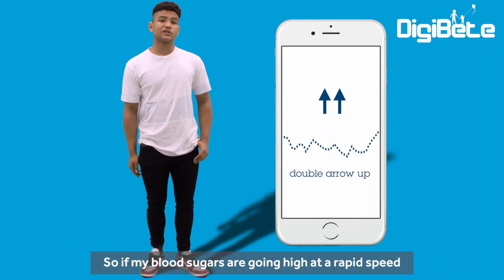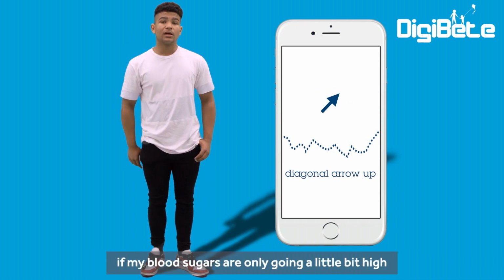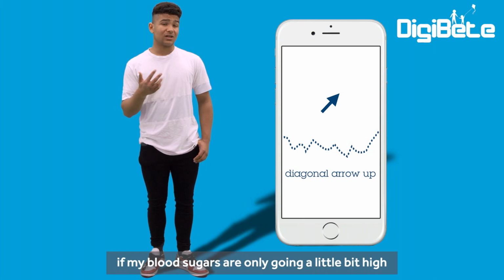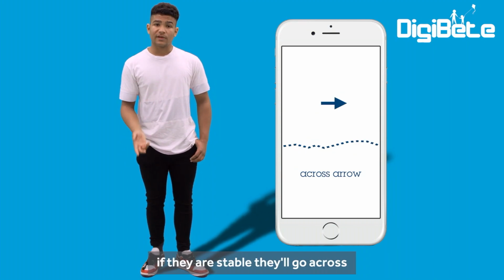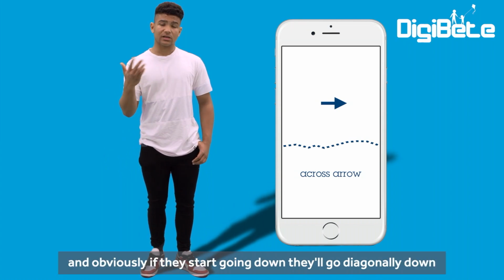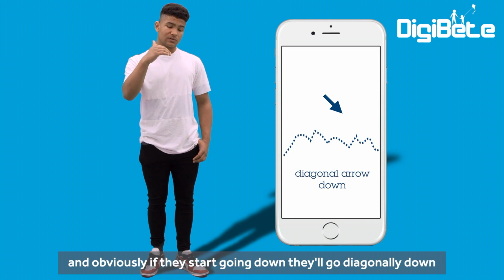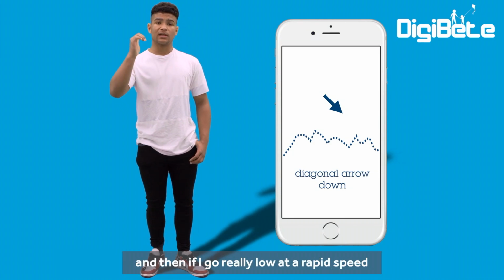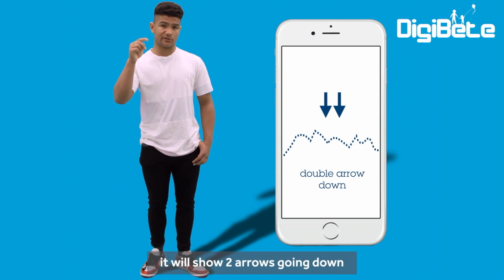So if my blood sugars are going high at a rapid speed, it will show a double arrow going up. If my blood sugars are only going a little bit high, it will just show an arrow going diagonal. If they're stable, they'll go across, and obviously, if they start going down, they'll go diagonally down. And then if I go really low at a rapid speed, it will show 2 arrows going down.